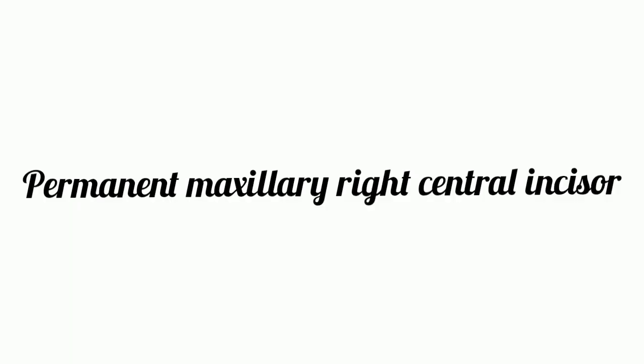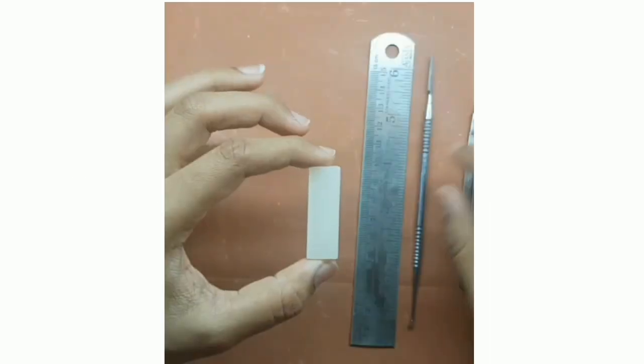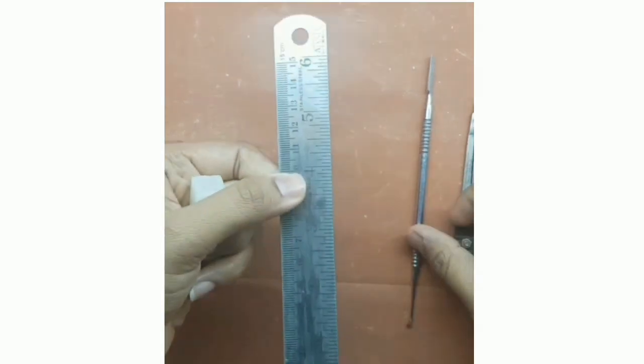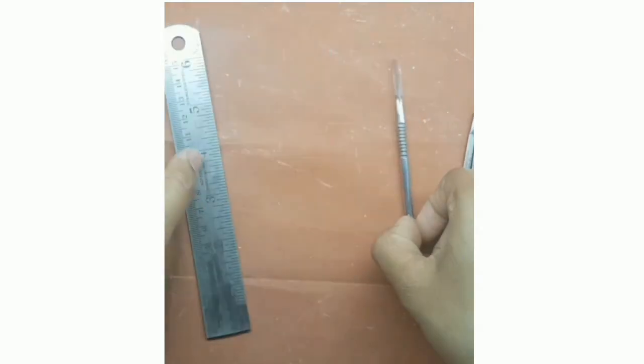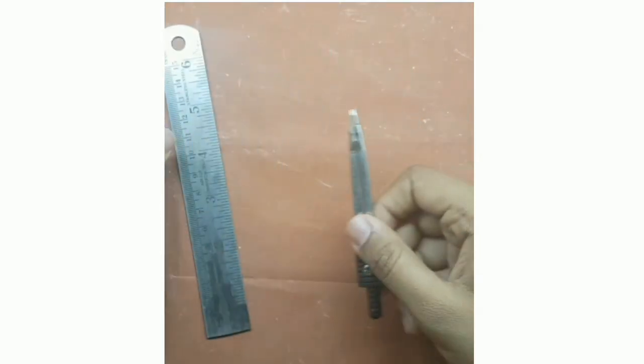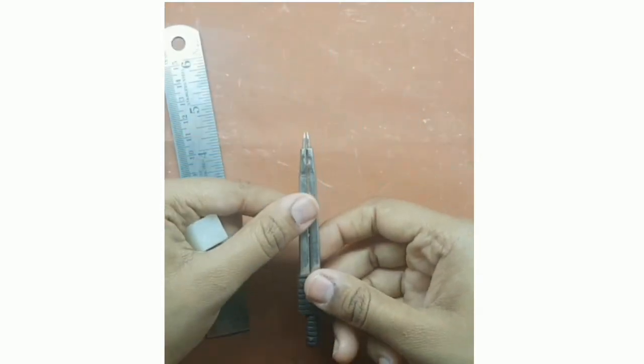The carving of permanent maxillary right central incisor. The materials required are a wax block, a measuring scale, a lecron carver, and a divider.